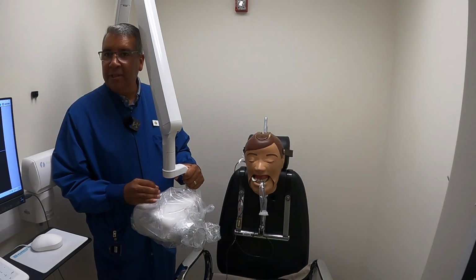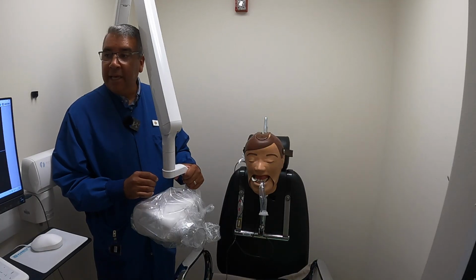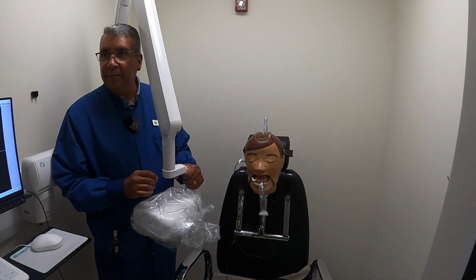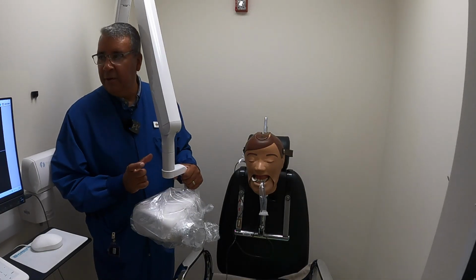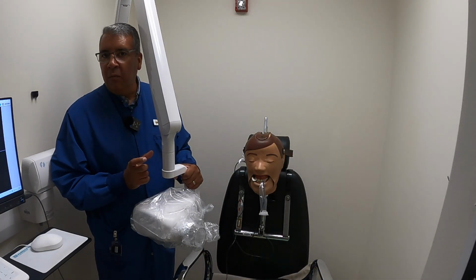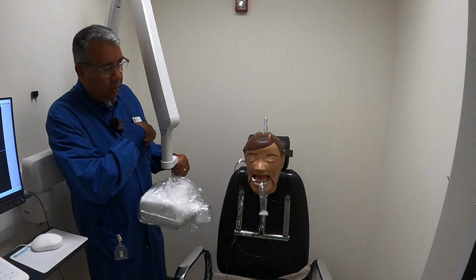We only reference the teeth that we are trying to take. In this case, it's the premolars, right? It is the horizontal angle of those teeth that we're interested in. What direction is that horizontal going in?